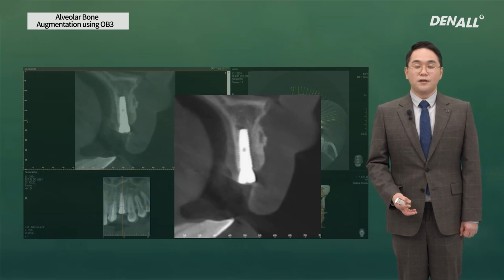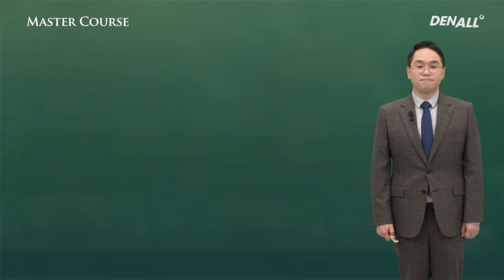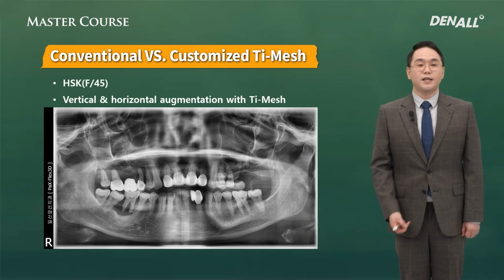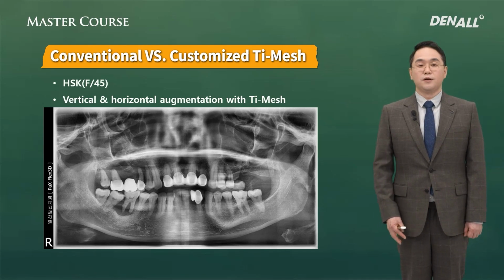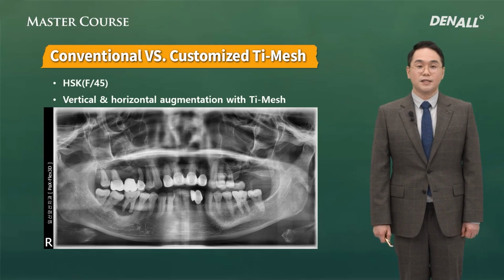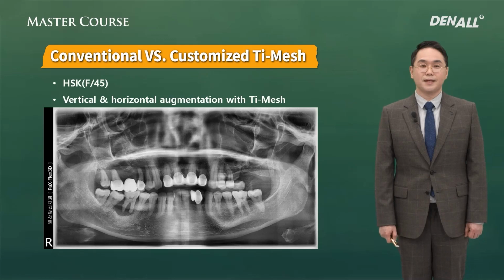Let's have a look at another case where it can be used. The reason why I prepare this case is that in a case where conventional titanium mesh can be used, but when we use the Jawbuilder, I want to show you how implant placement can be made easy, so we can compare those two.